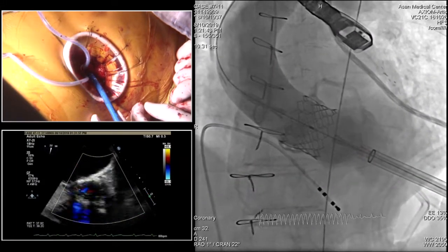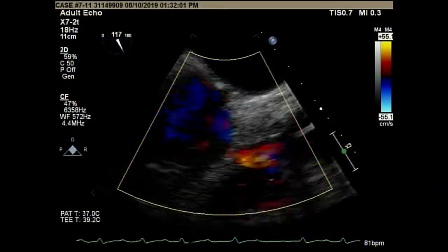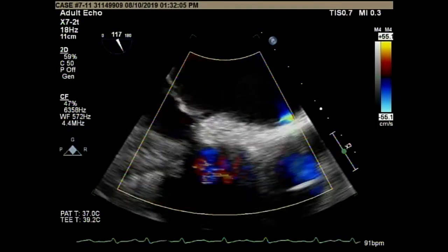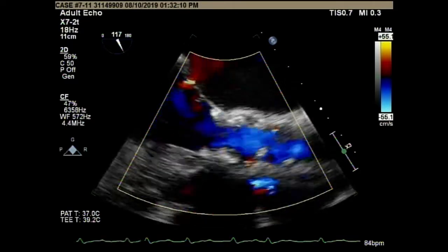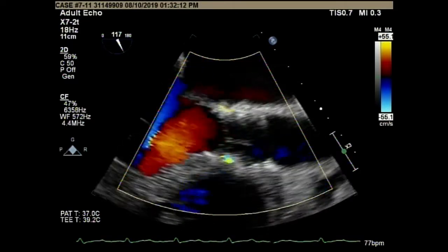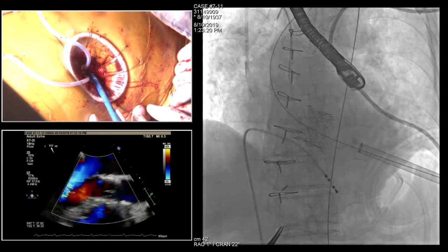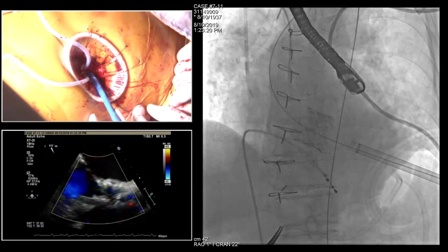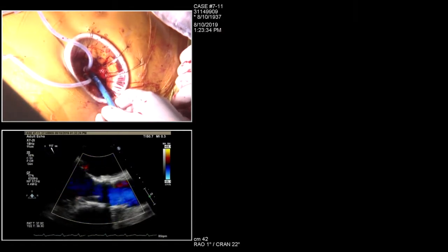Okay, Professor Kim. So in Korea, nobody's using carotid protection, right? Yeah, not yet available, but I think it's just mild. Just mild? Yeah. Devices, but in selective cases. Okay, can you see the TE image over there? One carotid artery was totally occluded. Yes, we see the TE. Okay. Less than mild. Just mild. Okay, we're going to check the angio, the fluoro, and zoom.